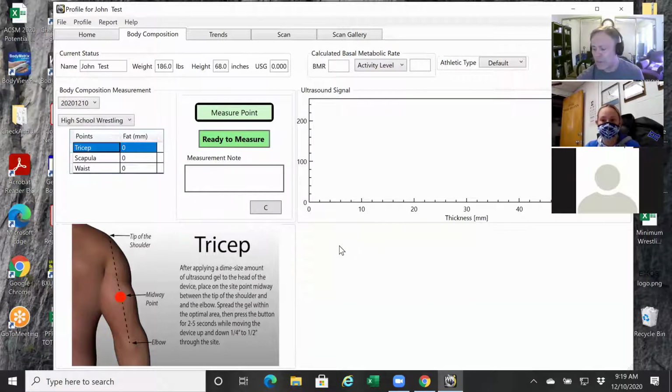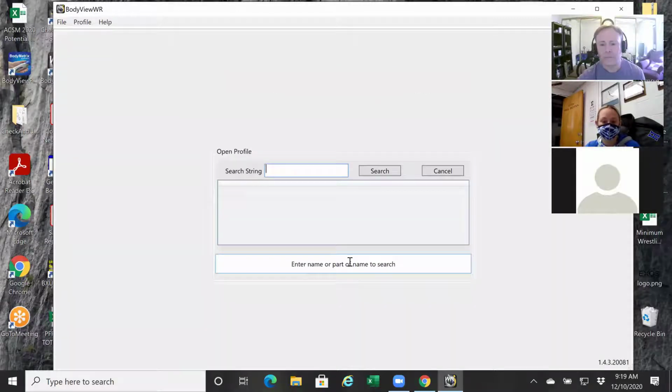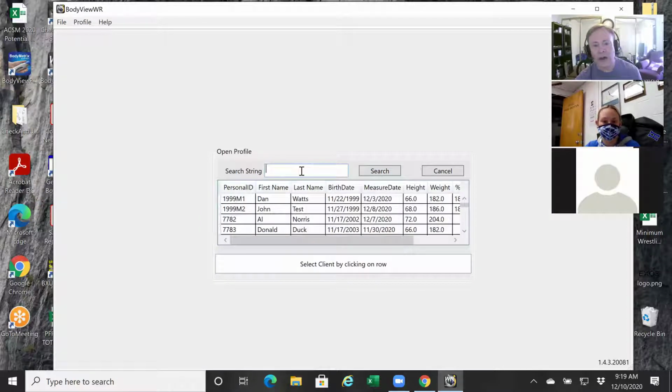If we go back to the home page, and I apologize, some of this is redundant. I just wanted it to resonate and hopefully stick with you guys. Let's say we did create a profile already. We're going to come back here to open up that profile. You can either click search or you can just type in the last name and click search.